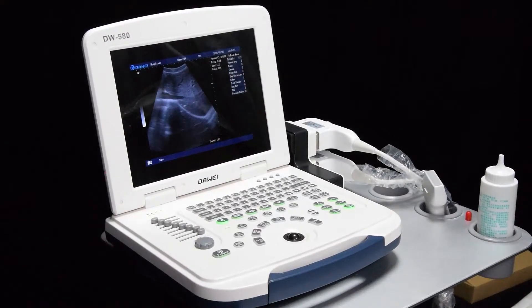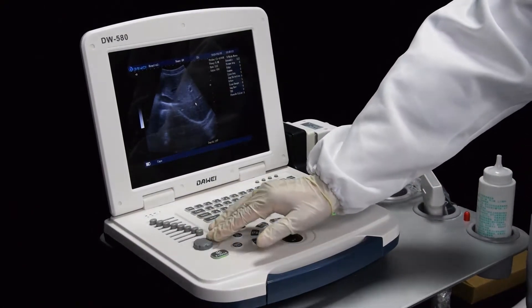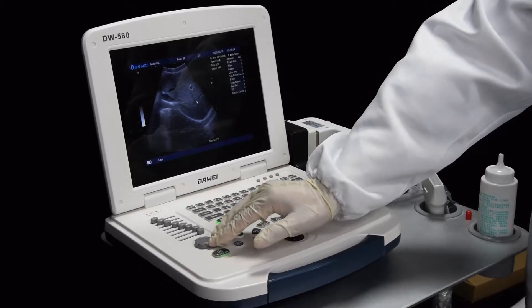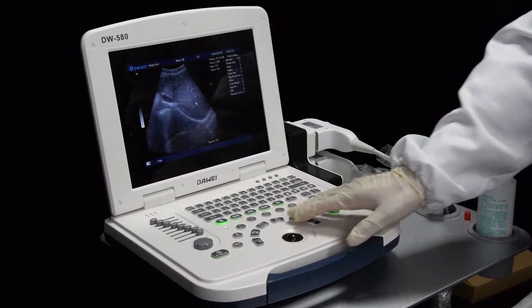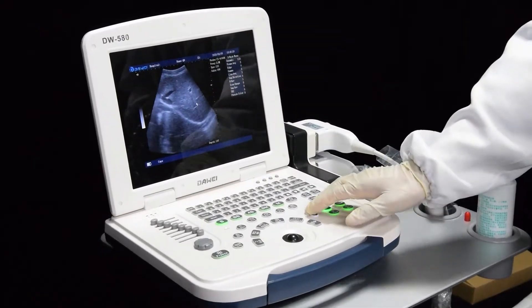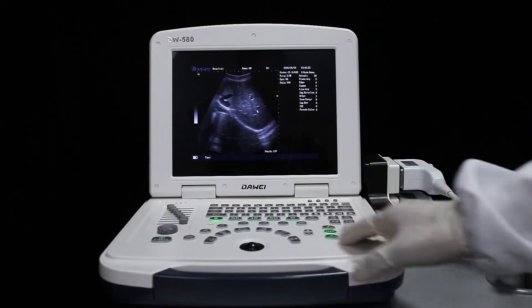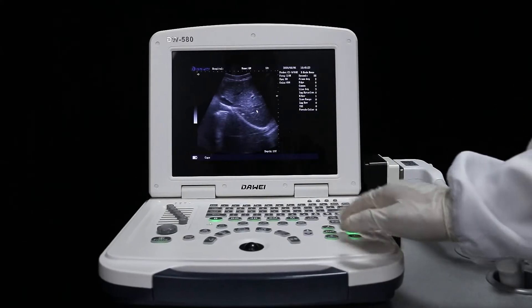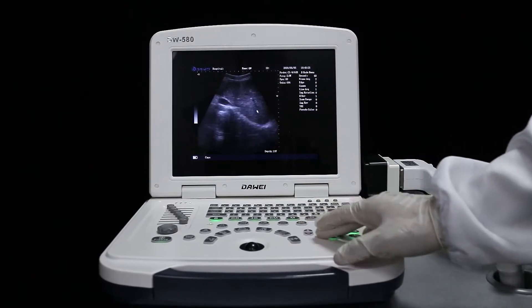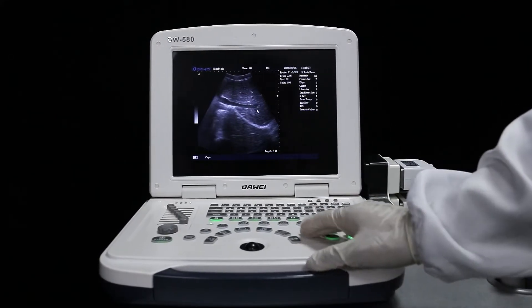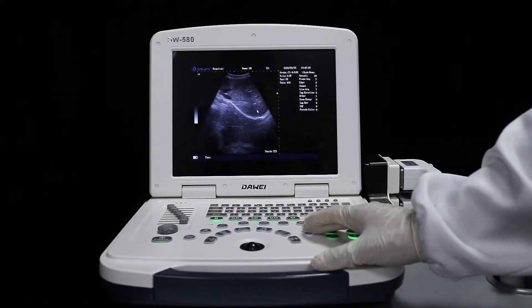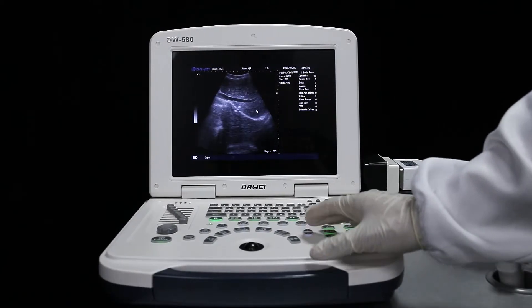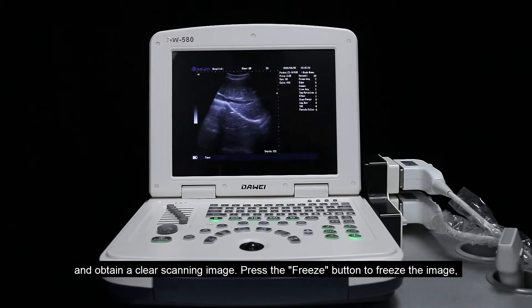Adjust the gain, frequency, dynamic range, and other parameters to obtain a clear scanning image.